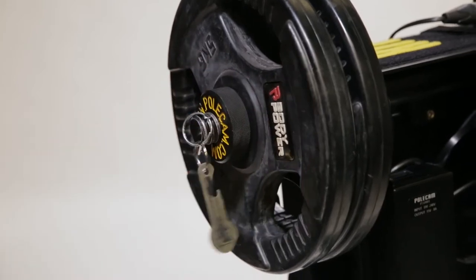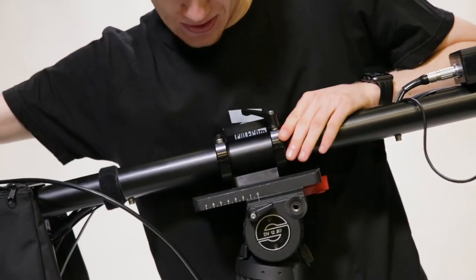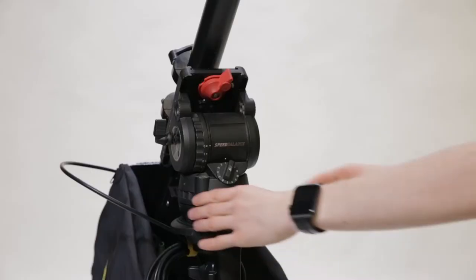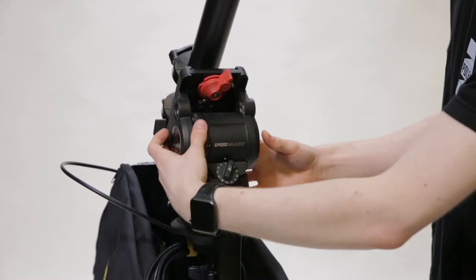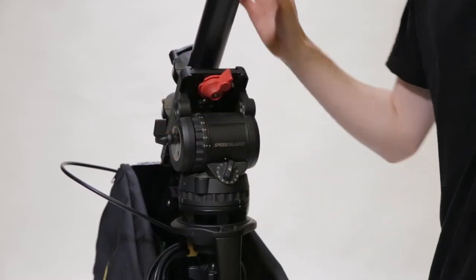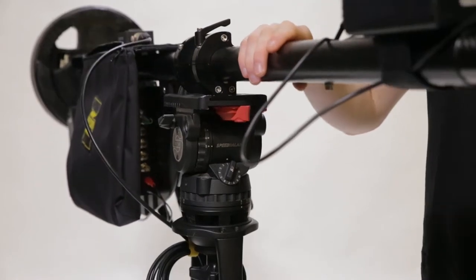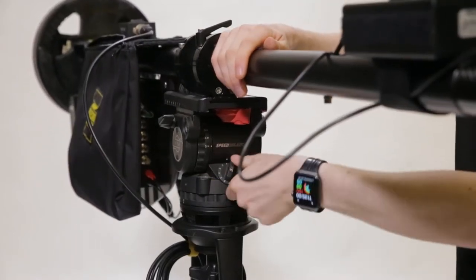Once your weights are attached, be sure to adjust your point of balance so that the system is easy to operate. Engage your friction to a comfortable setting and also engage your counterbalance to the maximum. Please note you may need to bring your head level in order to do so.